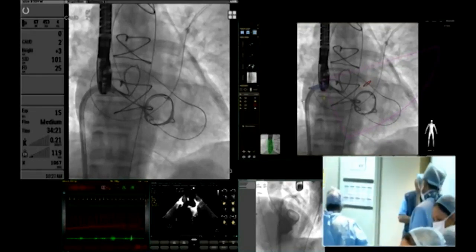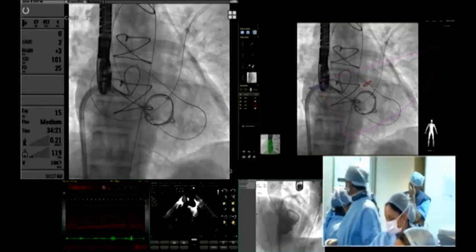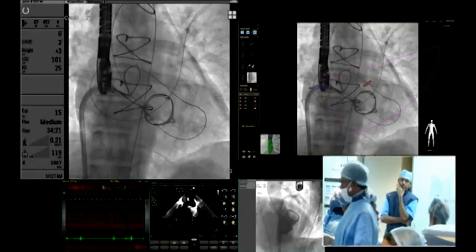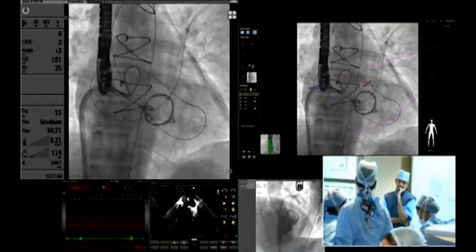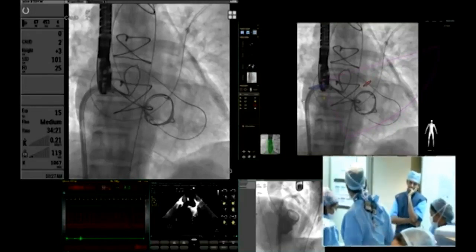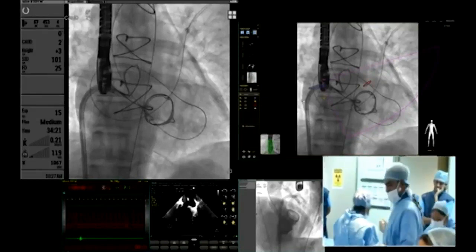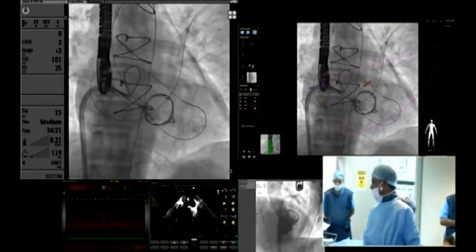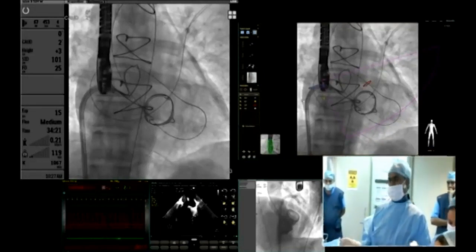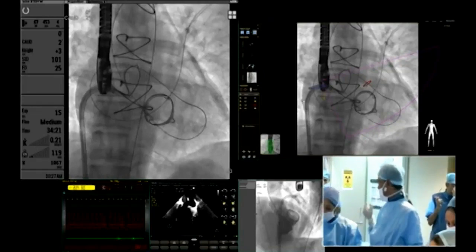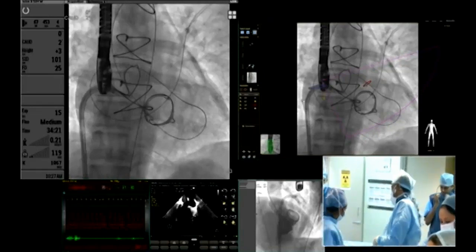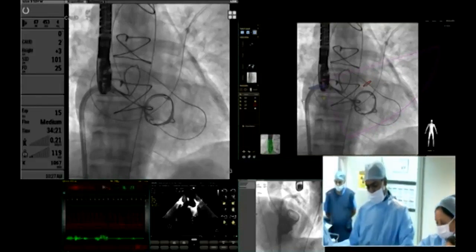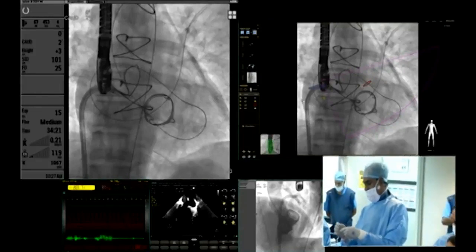That is one of the ways of crossing any sort of tortuous turn — you do balloon-assisted crossing. You have a low-profile balloon initially across. What I am saying is you inflate a balloon in the sheath, part of the balloon into the sheath and part into your guiding catheter, both close to each other. That will form a cylinderized unit which can slip through the defect.